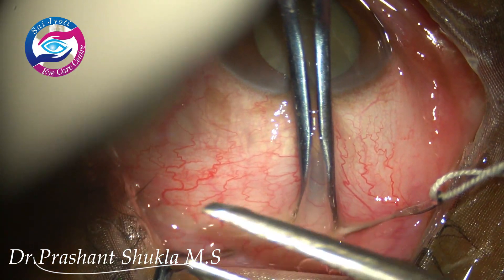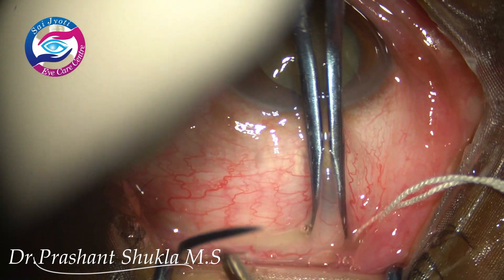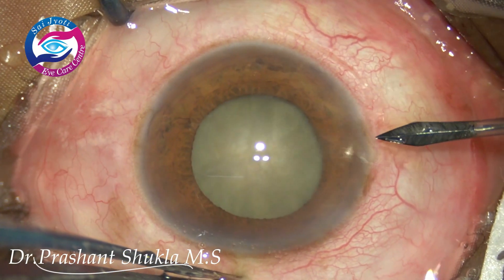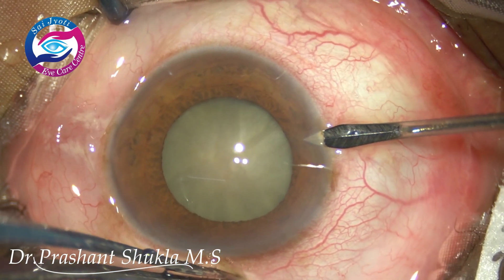The other eye of the patient was operated about 3 years back and we encountered multiple problems of eye face. The link is given above if you want to watch it.